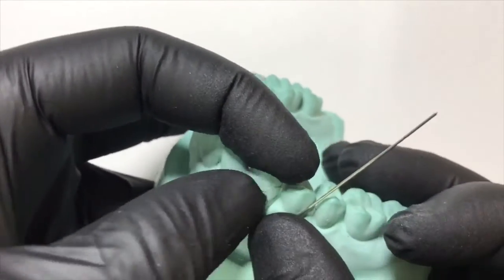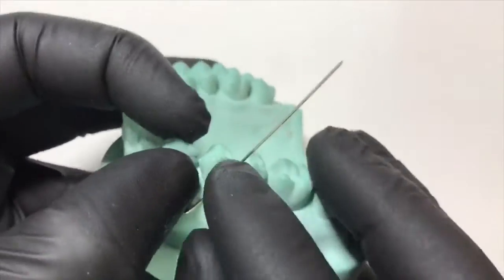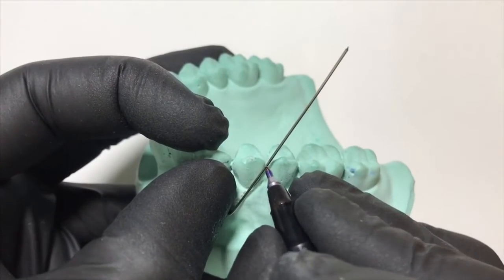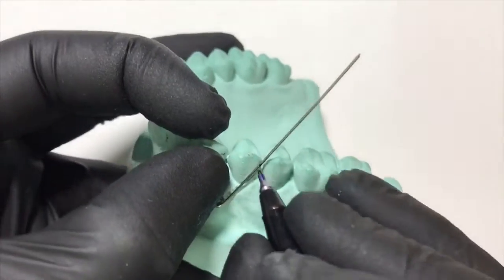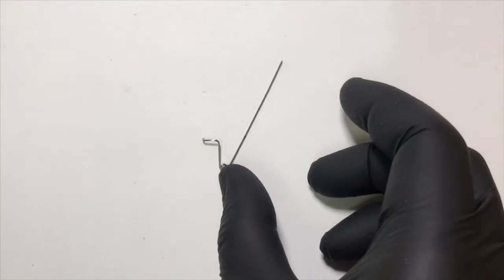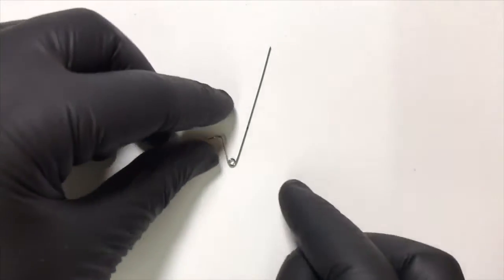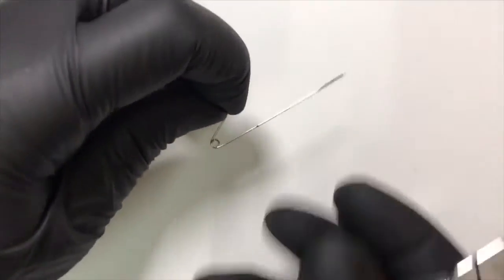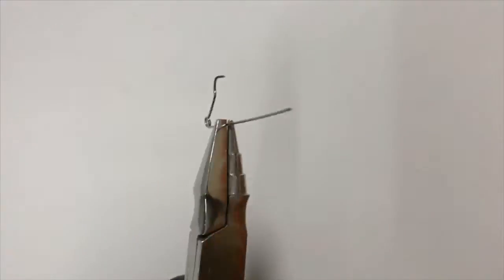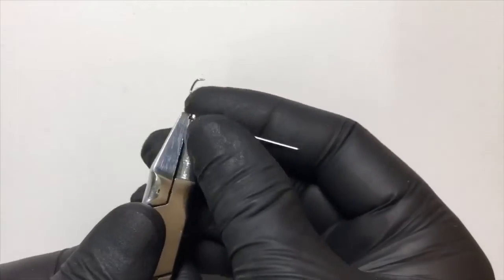We do a marking after checking the cast adaptation for where the retentive arm goes into the embrasure between the two premolars. At that marking we give a bend so that it goes into palatal adaptation. We deepen the bow by engaging this point in the beak of the universal plier and give a sharp bend.